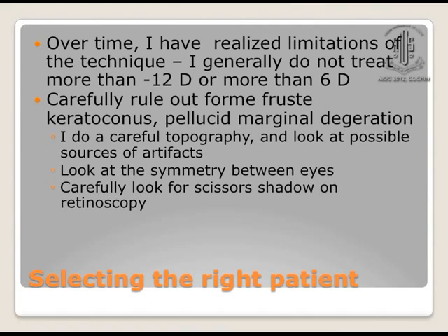Pre-operatively, it's also a good idea to rule out forme fruste keratoconus or pellucid marginal degeneration. And it is not only a diagnosis from the topography. There is no substitute to doing a topography, but I would also look at other clinical data that you have. You should look at the symmetry between the two eyes.